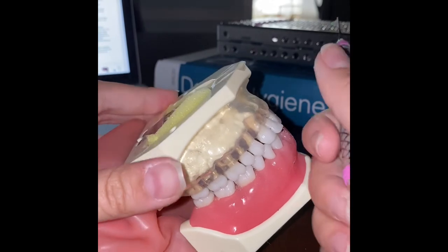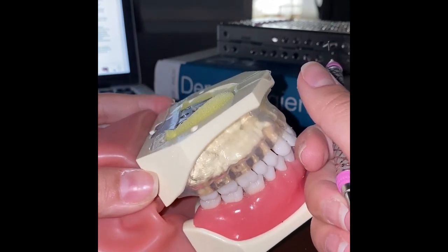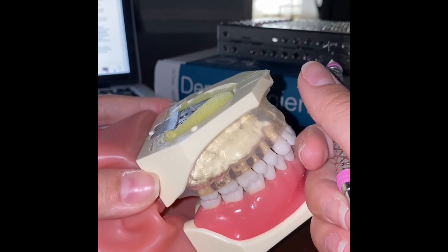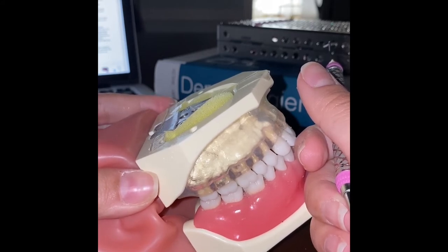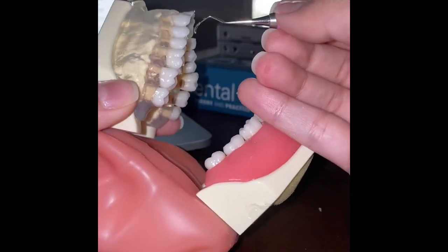For posterior teeth, we begin at the most distal tooth and work forward. We begin at the distal line angle and instrument until fully interproximal. We remove the instrument, return to the distal line angle, and work mesially with the working end pointed mesially. I'll show this now on teeth 3 and 4.